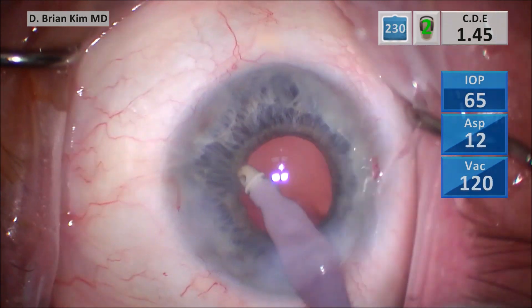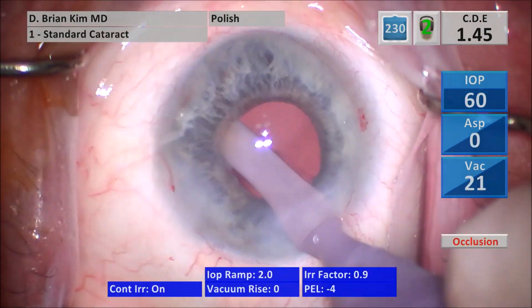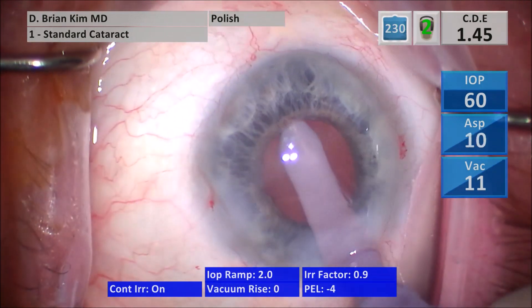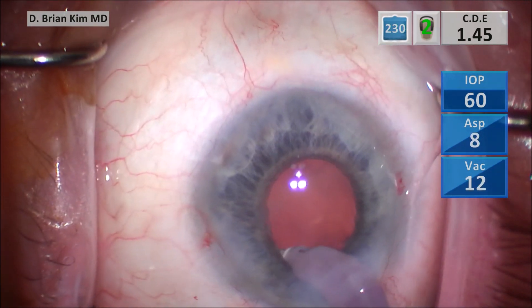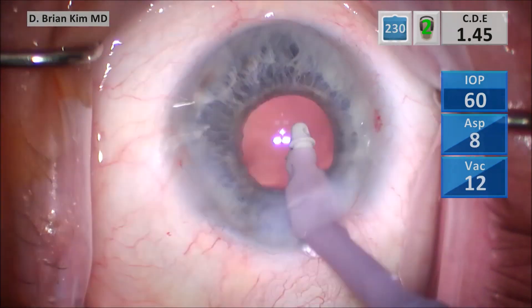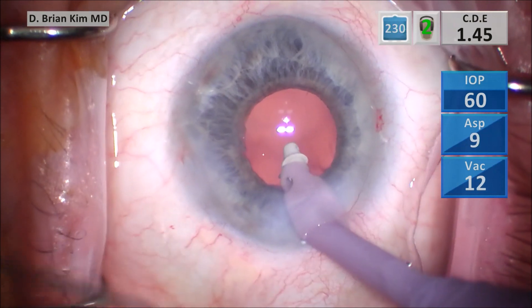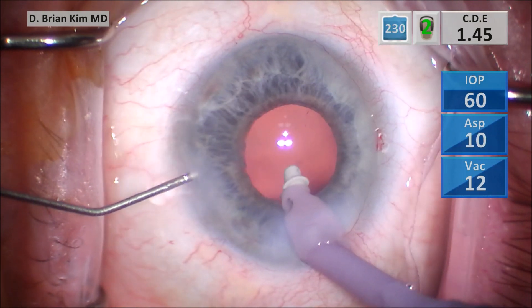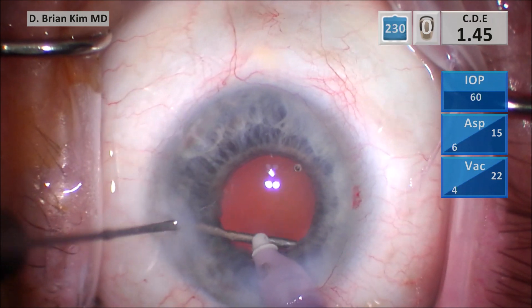Once the bag is completely clean of the cortex, I switch to polish mode just to polish underneath the anterior capsular rhexis edge, and then polish the posterior capsule surface. I'm going in with the BSS cannula, going into the sub-incisional space, and pulsing some BSS into the capsular fornix sub-incisionally.